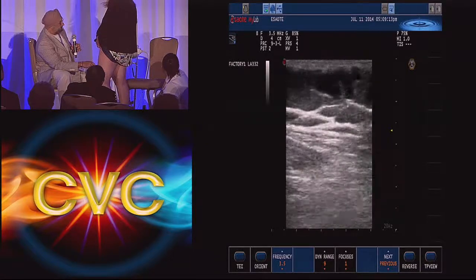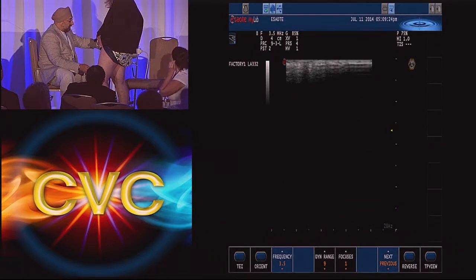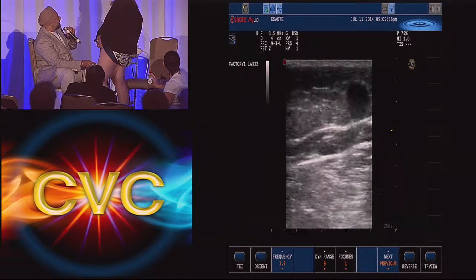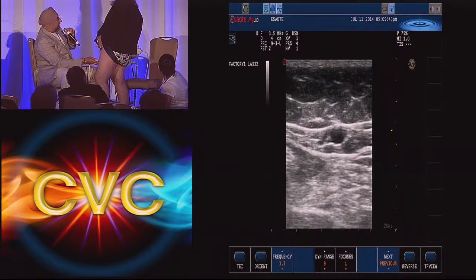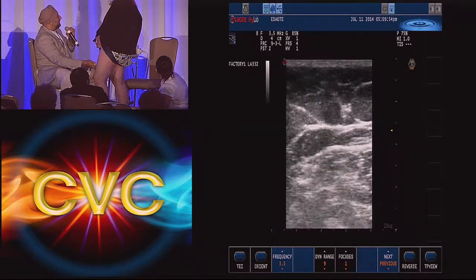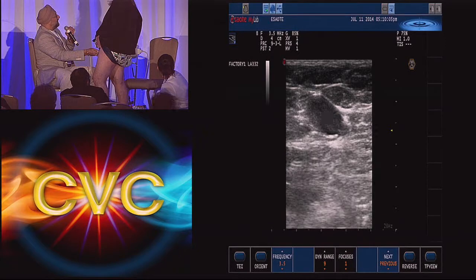And you can see how large that is. Watch how it enters the saphenous right there. You see it enter the saphenous, that branch? And if I follow it, there's the saphenous vein in the thigh. As I come down, it's in the fascia now, looks like the beautiful Egyptian eye. So in this case, you will ablate the saphenous from right here all the way up in the thigh to the saphenofemoral junction. You see how it got tortuous there for a little bit, like a little venous aneurysm, if you would, and you can see the flow.